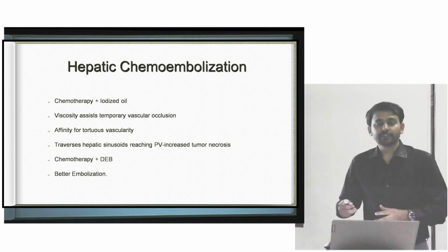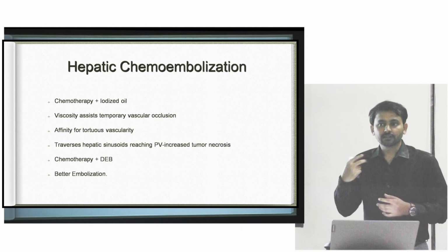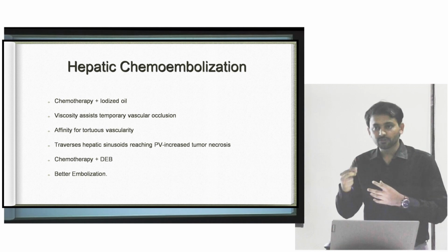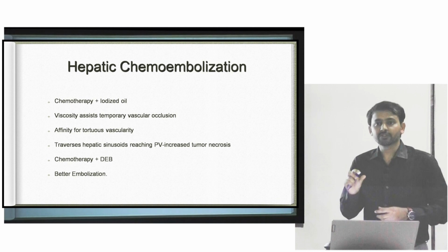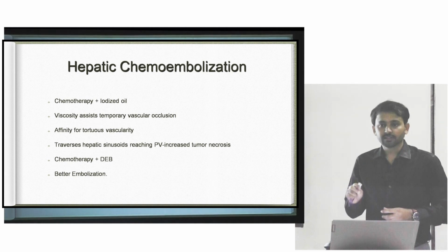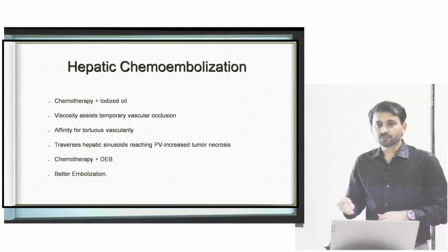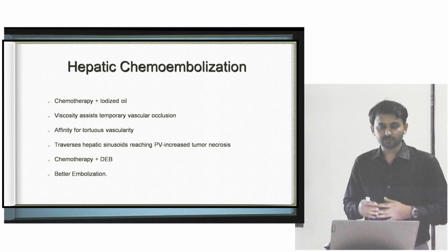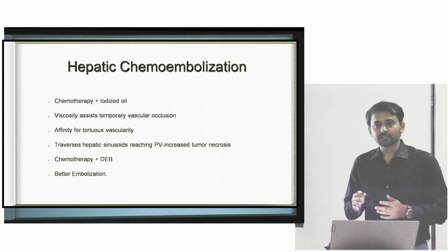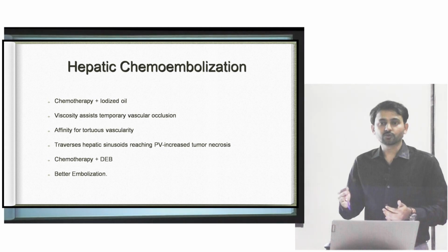In this we do a femoral artery puncture, and then go selectively or super selectively into the artery which exactly supplies the liver cancer, and we deliver chemotherapeutic drugs. The commonly used drugs are doxorubicin and cisplatin. TACE can be done in multiple sessions also. For large tumors, sometimes 10 to 11 centimeters, we do 2 to 3 sessions.